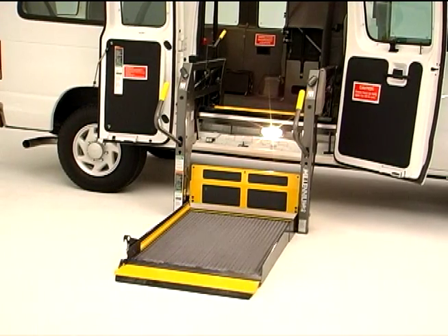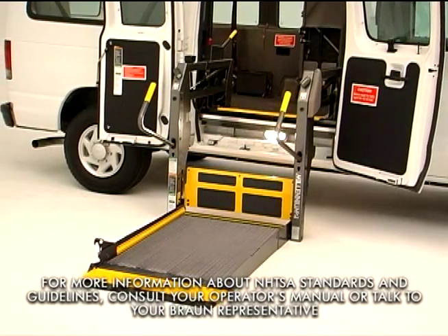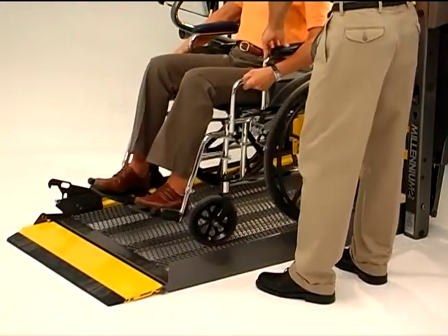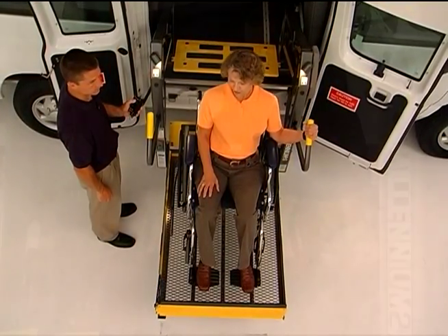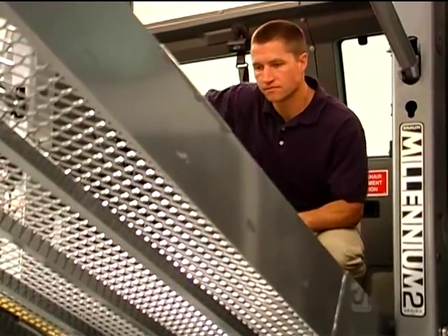Your Braun Millennium Lift is ADA compliant and fully satisfies the requirements of the National Highway Traffic Safety Administration, or NHTSA. The Millennium makes it easy for a trained attendant to load and unload passengers and mobility equipment by providing fully automatic operation of the lift, and easy-to-use manual features that can be used even in the unlikely event of a vehicle electrical system failure.